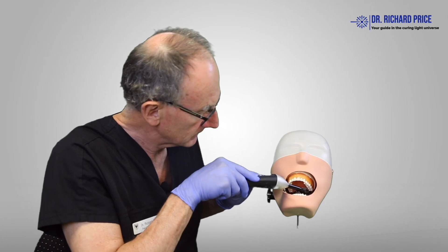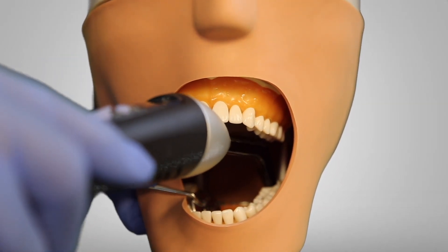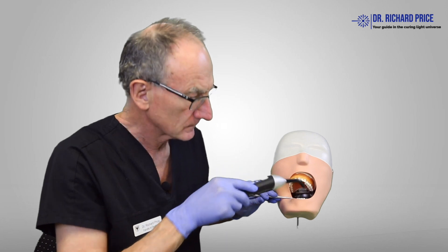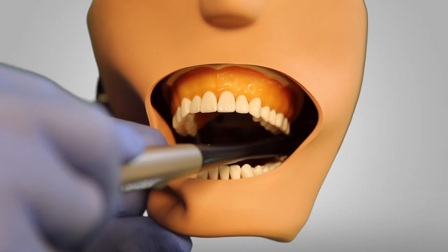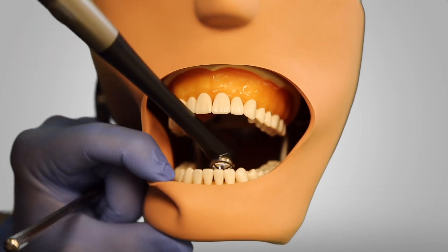Let's have a look again. We really have to open up very wide to access that last tooth back there, and even then it's kind of tricky to get in there. In contrast, if you take a low profile head such as this, then we can get this light in right to the very back and the patient doesn't have to open up quite so much.